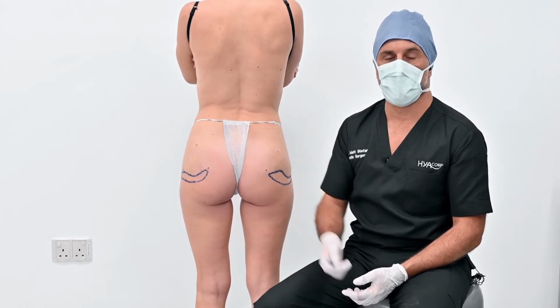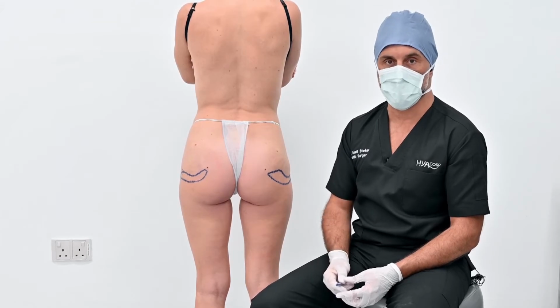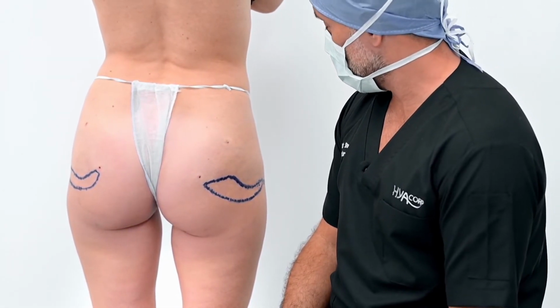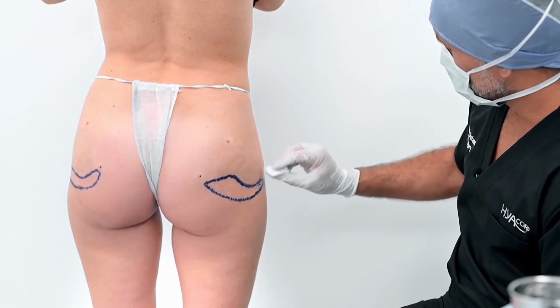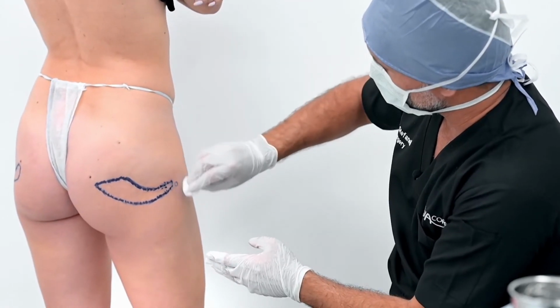And I'm going to go even further by doing the touch-up in standing up position. Of course, I need my nurse to come in and help me to get the same sterile condition. I will have a special focus on the entry point, of course.